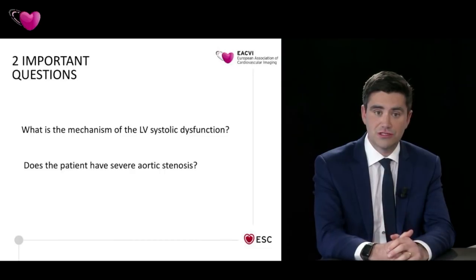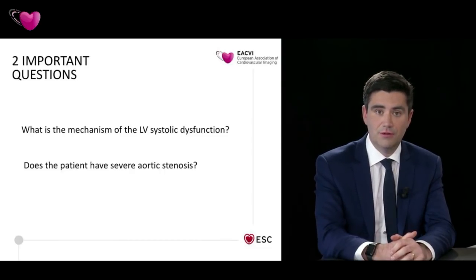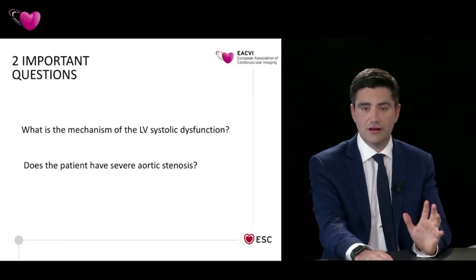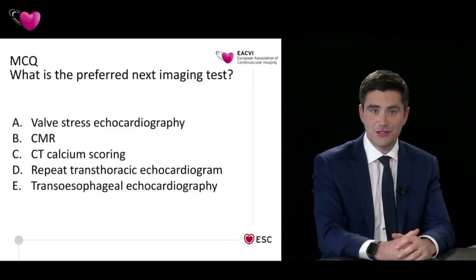And the second question was, does she have severe aortic stenosis? I guess linked to the first question. But we wanted to make sure that we had the diagnosis right from the echocardiography. So with these two clear clinical questions in mind, time for you to do some work.